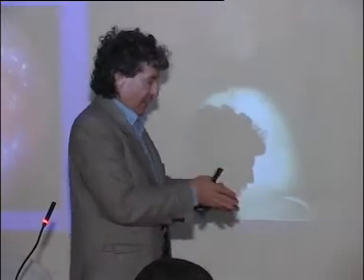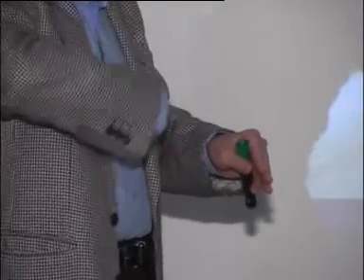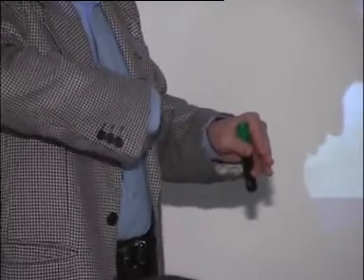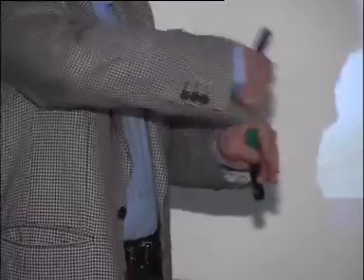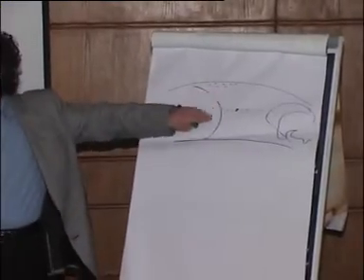Of course, if I make my procedure like this and my patient here, I'm facing the patient, I have a lesion here, okay? And I make my exploration, 60 degree, and I see a lesion here, okay? I'm going to show the point of entry here, and I'm back to the patient just to see what's happening. You show the second point of entry, but in more than 95% of the cases, you have a lesion on the posterior parietal pleura. Don't worry for that.